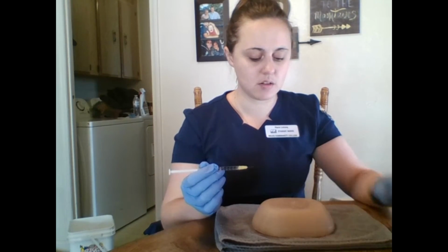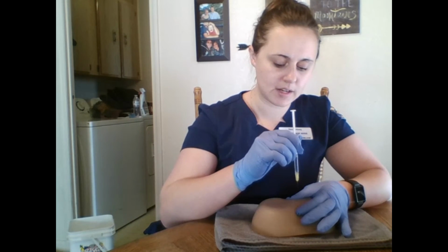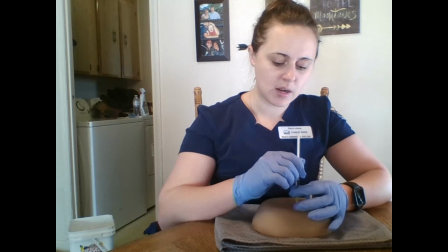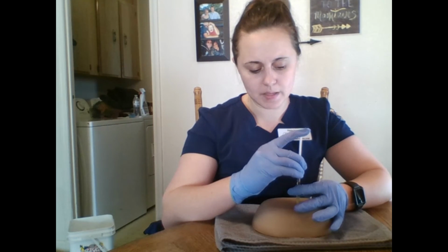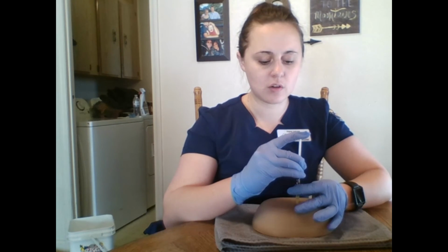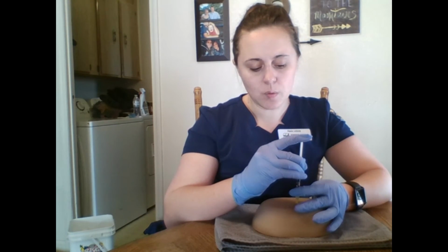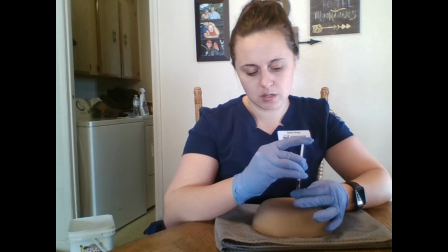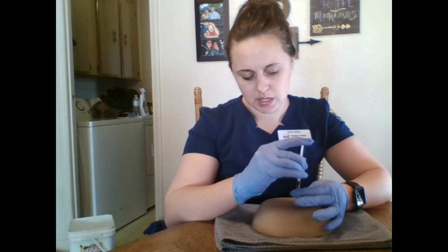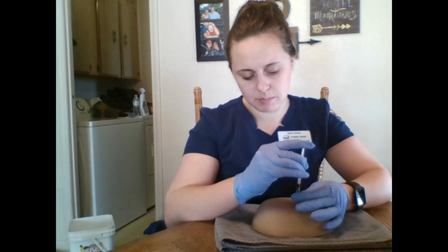Go ahead and take the cap off my needle. And with my non-dominant hand, pinching the skin, I'd want to go in at a 90-degree angle, straight in, and I want to hold the syringe and needle with my dominant hand, and slowly administer the medication. They now say that the slower you administer it, like over 30 seconds, the less chance of bruising there is. And we want to administer all the medication and the 0.2 amount of air that we have in the syringe, because that helps seal the medication into the skin.